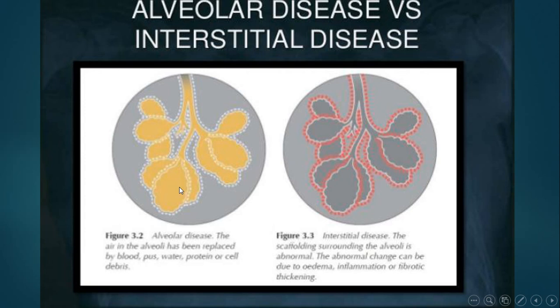Regarding the interstitial diseases, they are the diseases that affect the interstitial tissue, the part that supports the airspace, that supports the alveoli, keeping everything in its place.